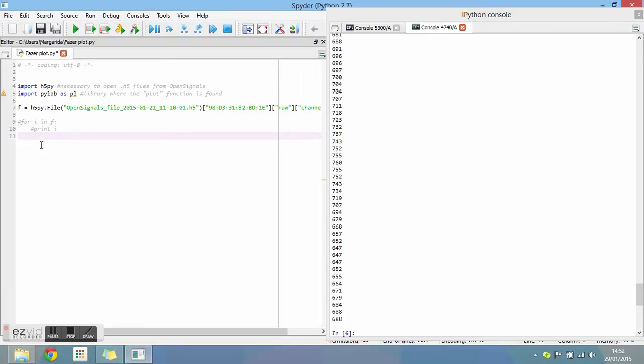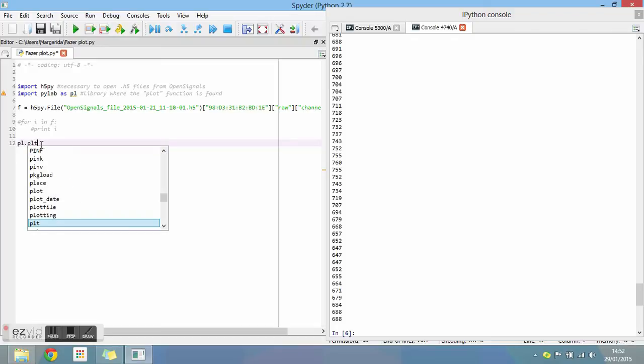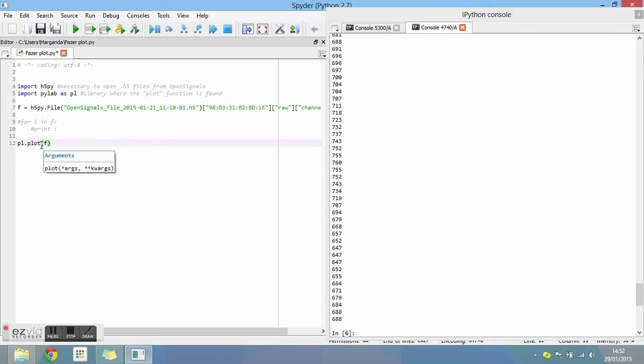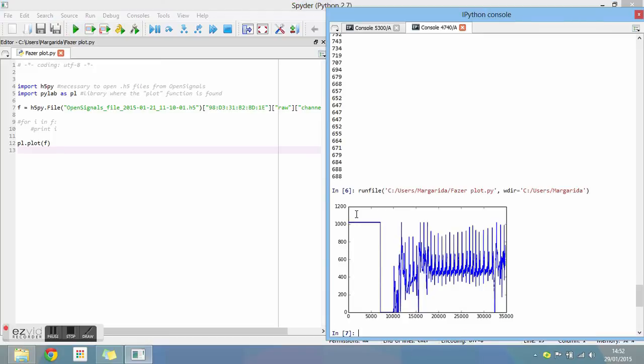To finally plot the graphic, type what you see on your screen and run the program. As you can see, the complete graphic appears on the console.